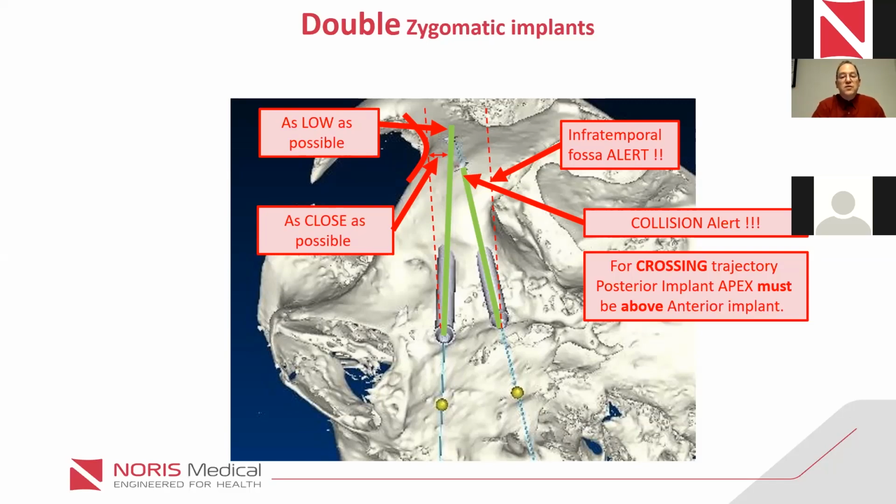And this comes back to the question I was asked before by George, that the implant will not be long enough in the bone. And this is a shame, because if we could have it anchored in the longer bone, then it's going to be stronger. So this is one reason why we want to perforate, to make sure that now we can measure the length of the implant so that the apex of the implant will come to the cortical bone and will not go further out.